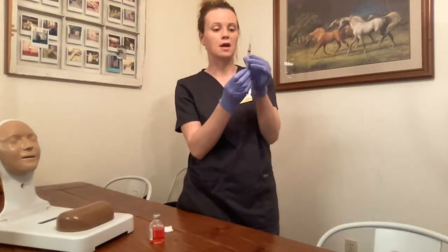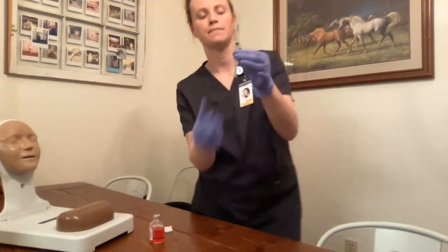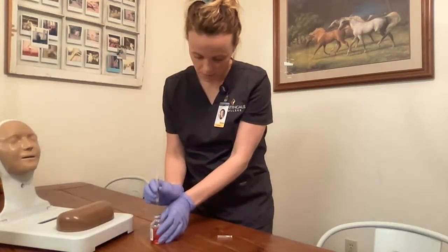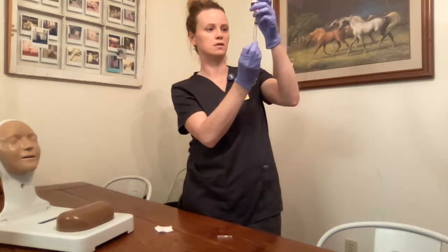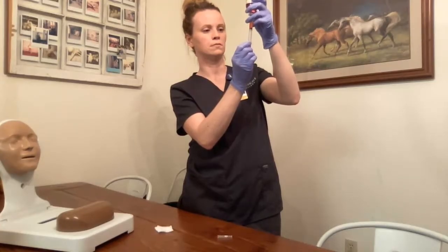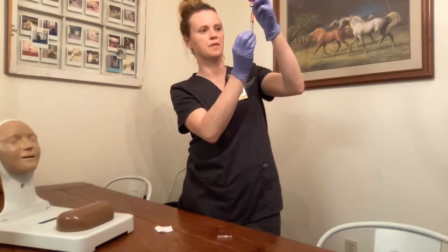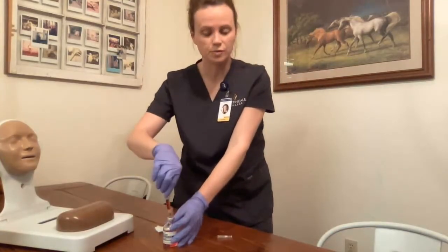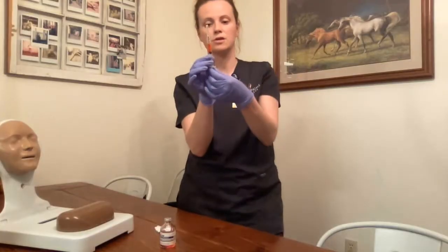I draw up the desired amount of air — 1.5 milliliters — holding the syringe like a pencil, needle up, cap on. I then inject the air into the medication vial, invert it, and pull back to draw up the medication. I check for air bubbles — I can either tap or fully inject the air back into the syringe to remove them. There are none. I recap the needle using the scoop method. My medication is ready to go at 1.5 milliliters.